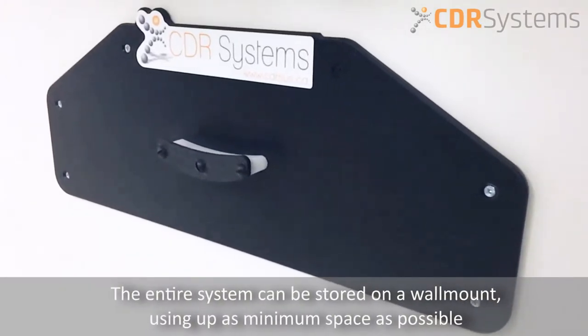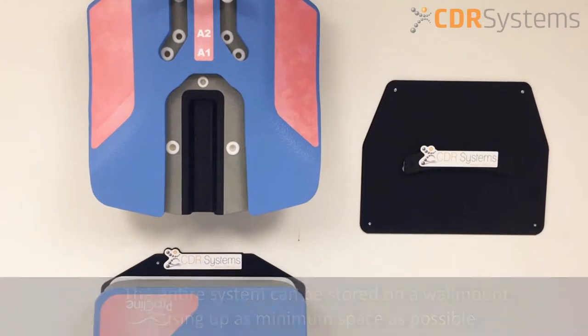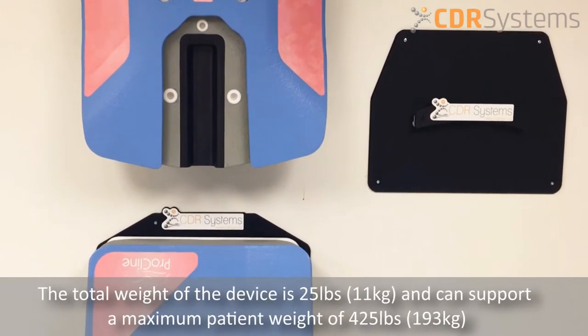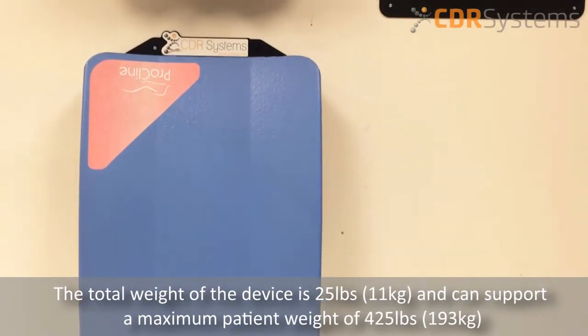The entire system can be stored on a wall mount using as minimum space as possible. The total weight of the device is 25 pounds and can support a maximum patient weight of 425 pounds.